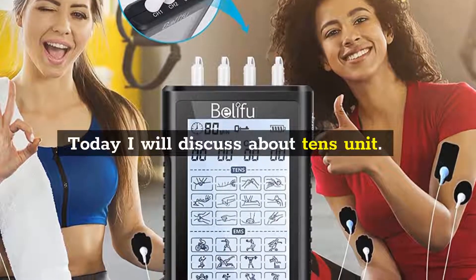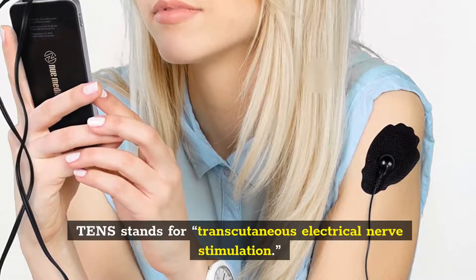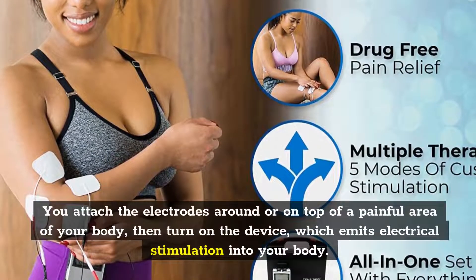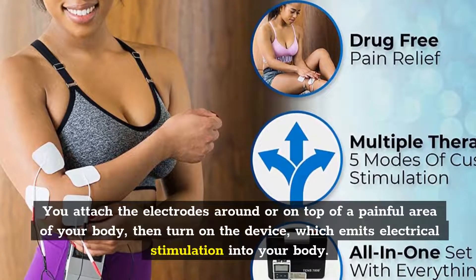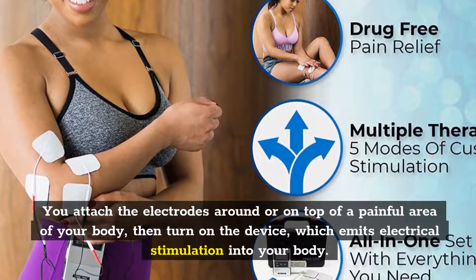Today I will discuss about TENS units. TENS stands for Transcutaneous Electrical Nerve Stimulation. You attach the electrodes around or on top of a painful area of your body, then turn on the device, which emits electrical stimulation into your body.